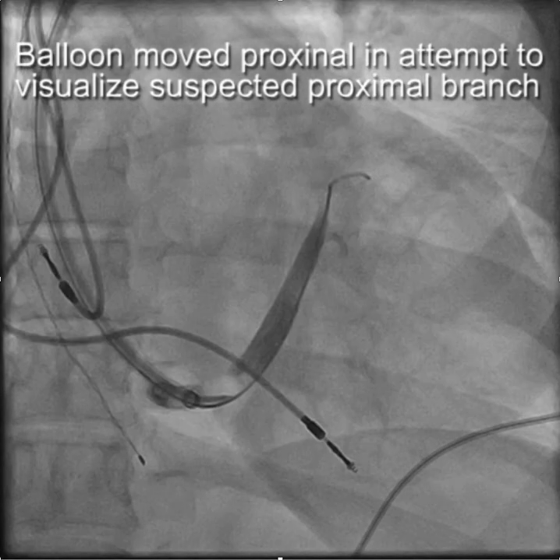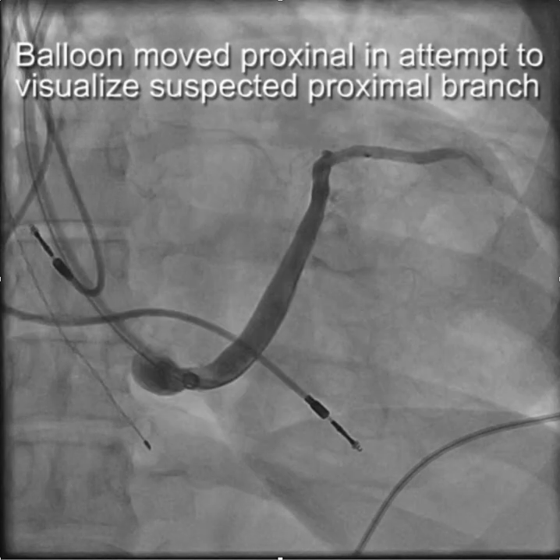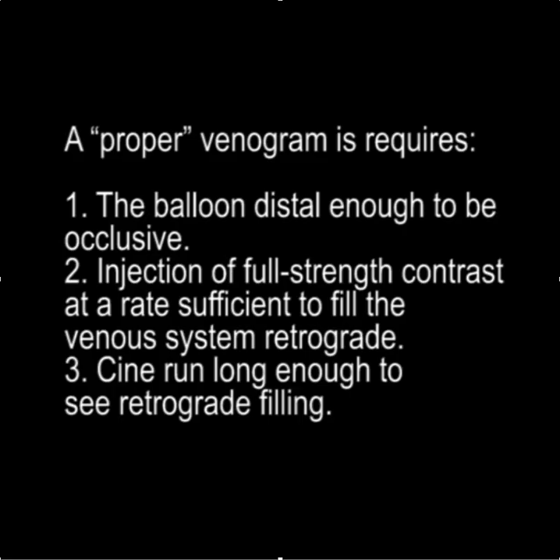What often happens is the balloon was brought back to the os of the coronary sinus and inflated in an attempt to see a branch close to the os. But in this position, the balloon is not completely occlusive, and we still don't see any proximal branches. A proper venogram requires that the balloon is distal enough to be occlusive, that the injection of full-strength contrast is at a rate sufficient to fill the venous system retrograde, and that the cine run is long enough to see retrograde filling.